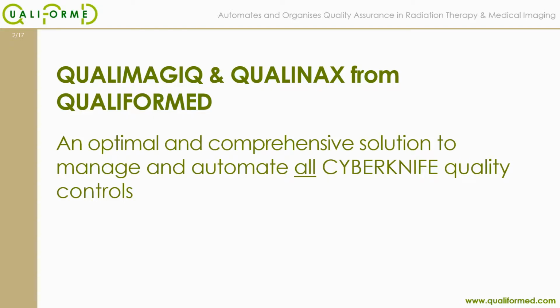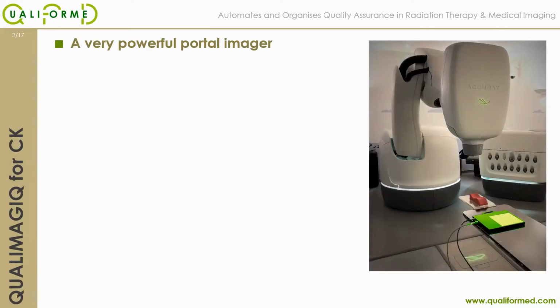You will discover that it is a very comprehensive solution, whose purpose is not just to automate a few CYBERKNIFE controls, but rather to automate and manage the entire set of quality controls for a CYBERKNIFE. Our solution includes a portable high-energy portal imager because, as you are aware, a CYBERKNIFE has two low-energy portal imagers, but they are only provided to control the patient's position and not radiation beams.